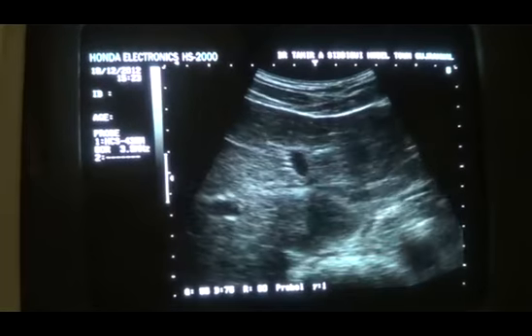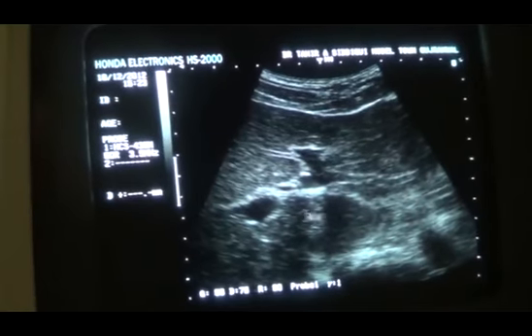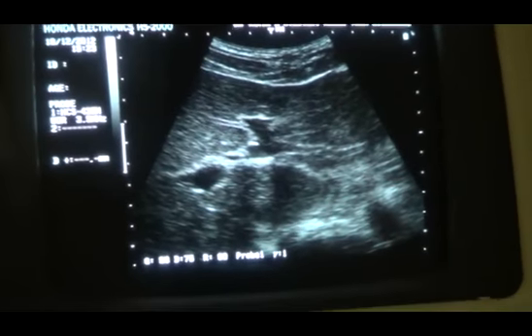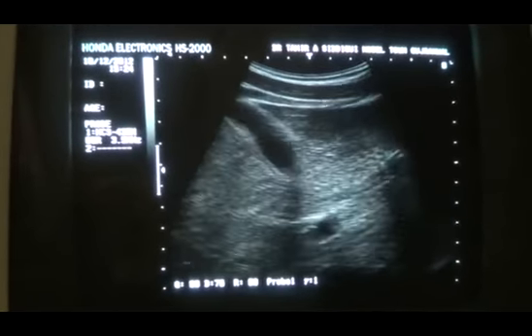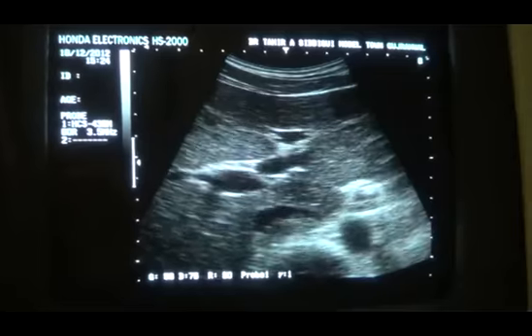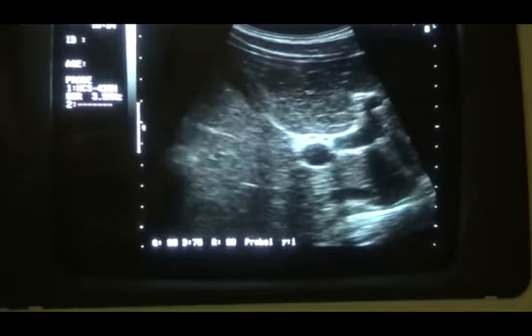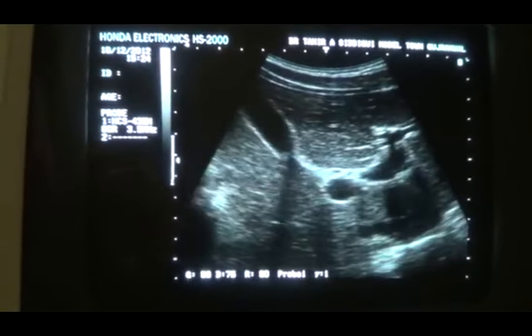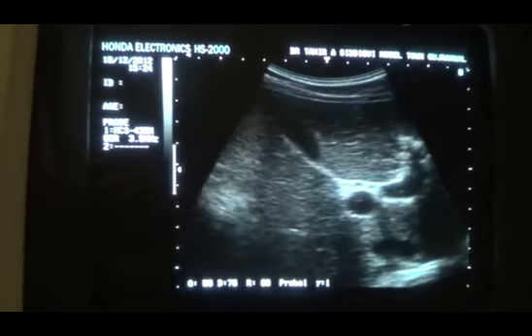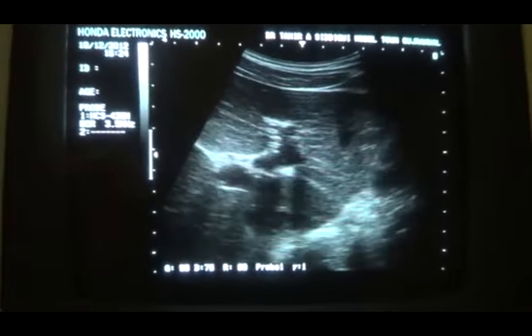Now, this is the ligamentum venosum, left lobe of the liver in transverse section, ascending portion of the left portal vein. Now here you can see that both right and left portal veins together, with normal periportal echoes like this.